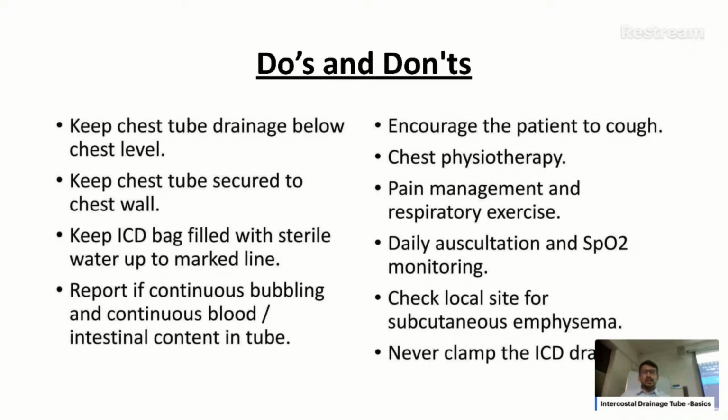Now do's and don'ts. We have to keep the chest tube below the chest level, so there's no backflow. The tube has to be secured to the chest wall, and the bag must be filled with sterile water up to the mark line, which is ideally at 100 ml.